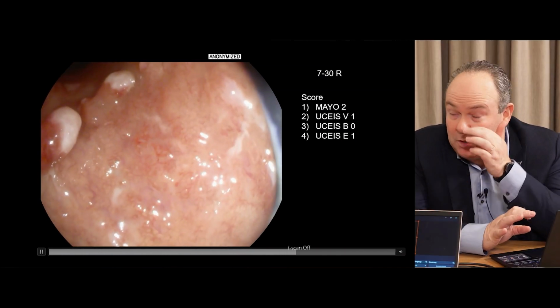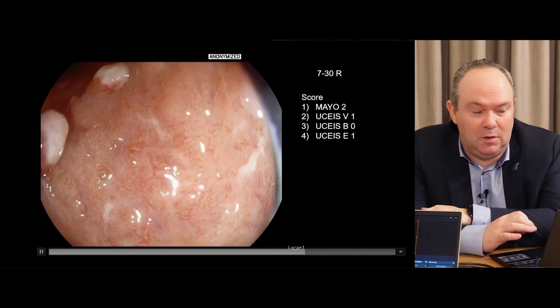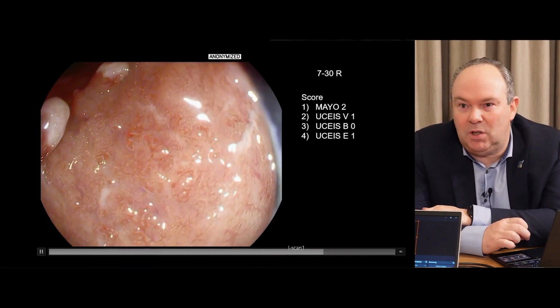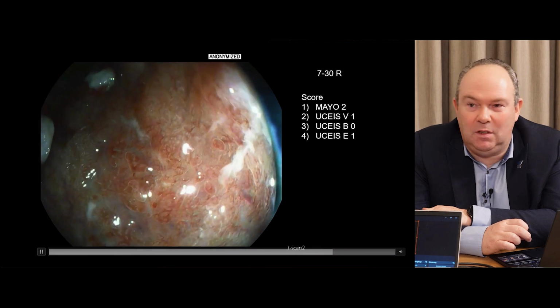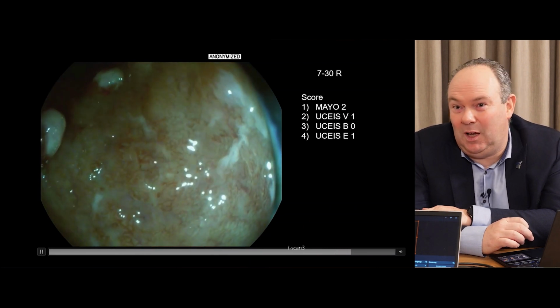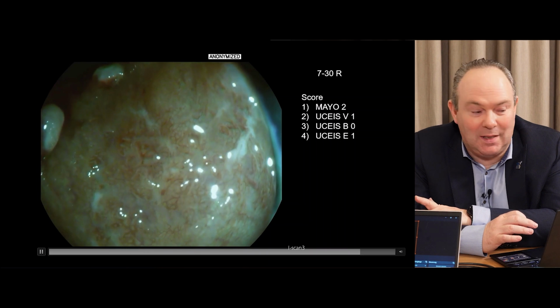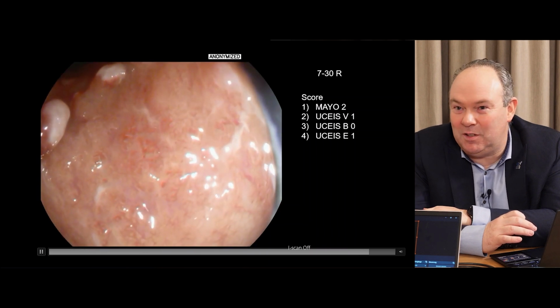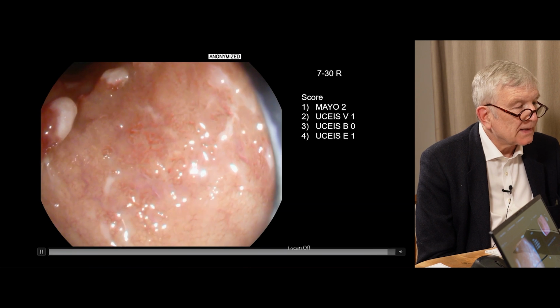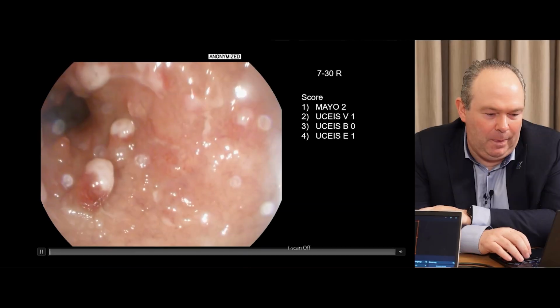So there's been some discussion on pseudopolyps where you should take them into consideration, but I think logically, it's a sign of bad inflammation and regeneration. So if you have many of these, I would take this into consideration for 2 reasons. First of all, it's a sign that the inflammation was bad. And second, the surveillance itself may also be more challenging. So that's why we take this into consideration for defining the surveillance interval.